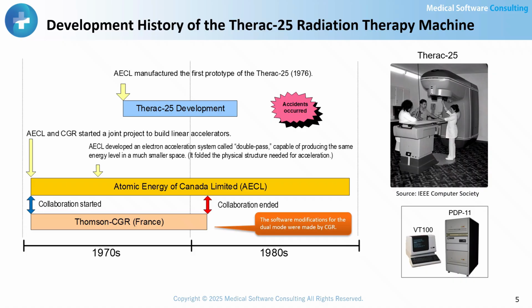This meant that highly safety-critical medical device software was developed under a joint arrangement between a French and a Canadian company, and then handed off from one party to the other. Such a process made the software particularly prone to hidden problems and risks. Those who had the opportunity to examine the Therac 25 software were surprised to find that there was almost no documentation available and no descriptions in plain English explaining the functions of different parts of the program. Moreover, there was no evidence that the software had undergone thorough testing together with the hardware prior to shipment.